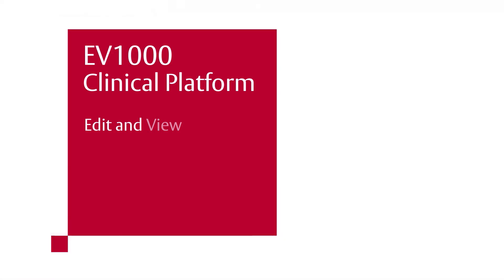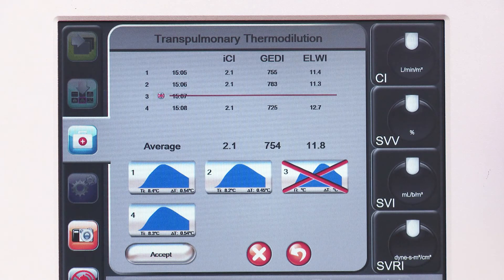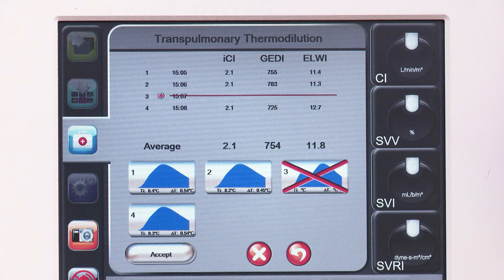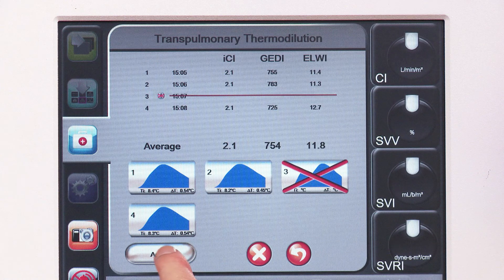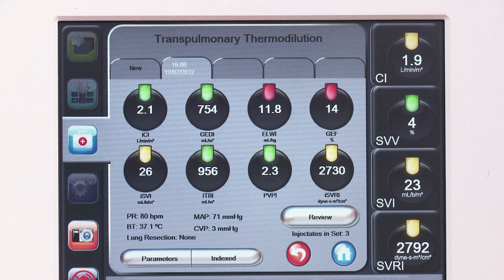Edit and view TPTD values. Touch Review. Touch each washout curve you would like to remove; a red X will appear over each waveform selected, removing it from the averaged values. The computer will edit out boluses that are associated with an alert or warning and have an X over the bolus. Touch Accept when you are done reviewing the washout curves. The average value will be used as the volume view CO calibration for continuous CO and for the volumetric TPTD values.